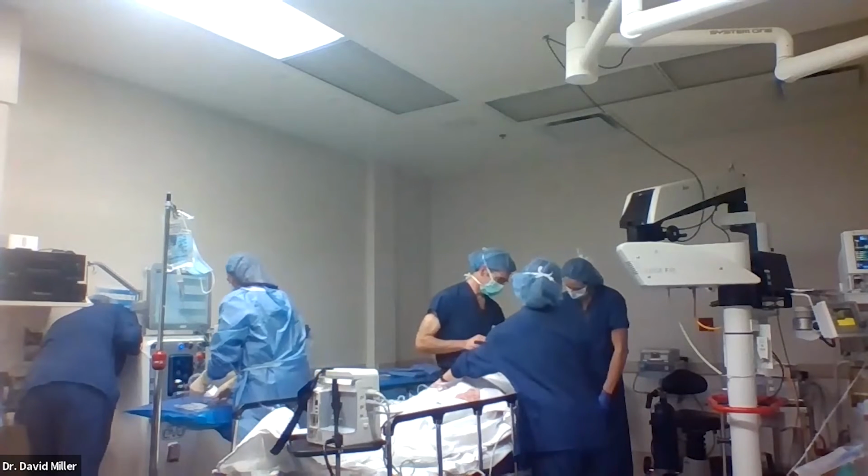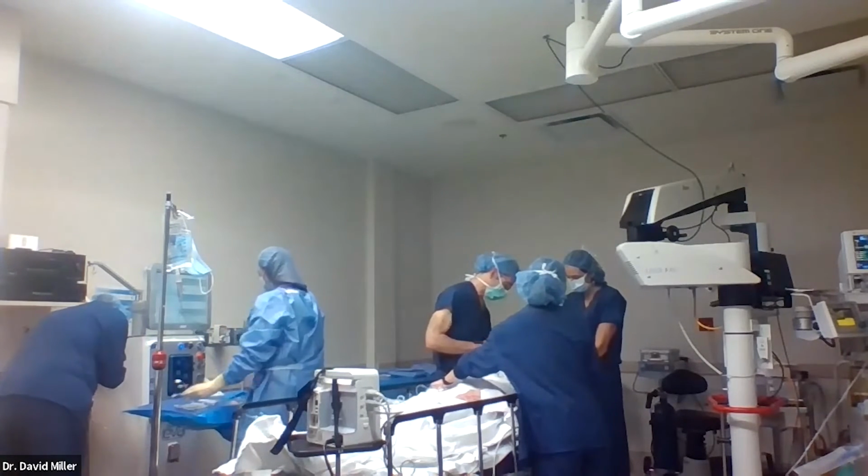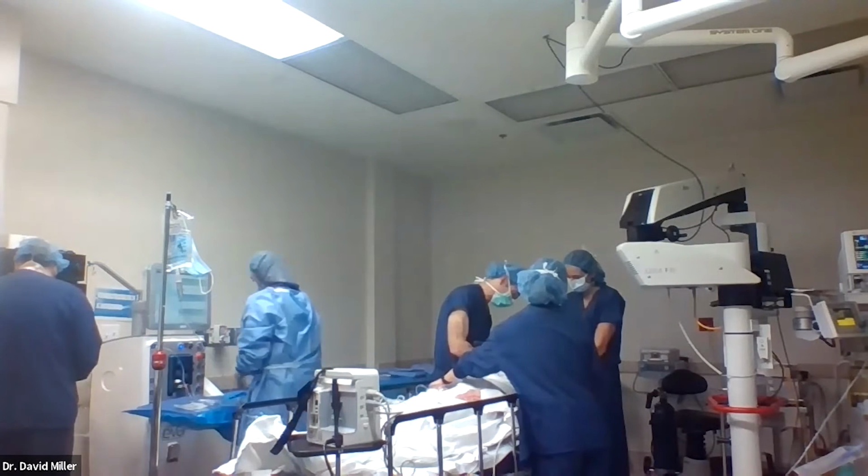Okay? Look straight up there. And stay nice and still. So he just looks right up at the ceiling. Nice deep breath. About 1/3 from the lateral canthus.